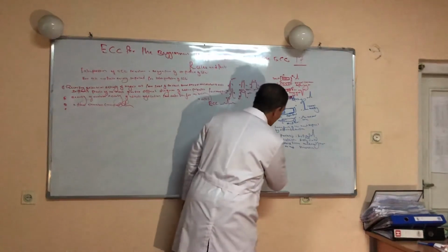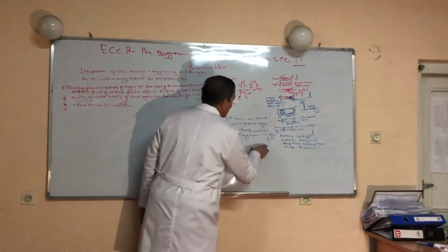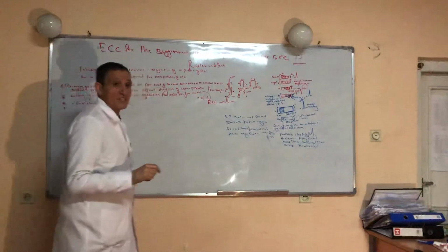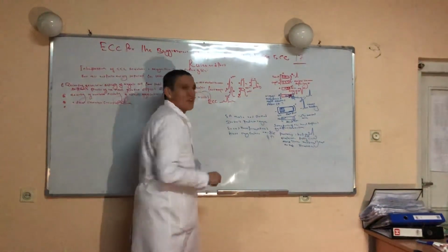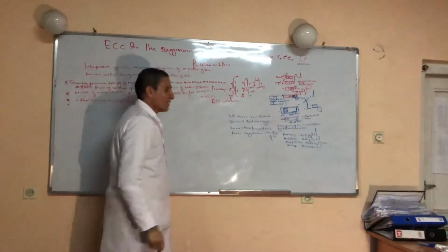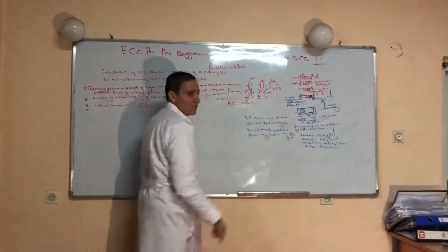Finally, the AV node. Before we discuss the conduction system of the AV node and SA node: depolarization of the SA node and AV node are very important points in the ECG. But unfortunately, we don't have any waves from the SA node and AV node on the ECG paper, because the SA node is a very small node, a tiny tissue, and SA node depolarization depends on calcium.